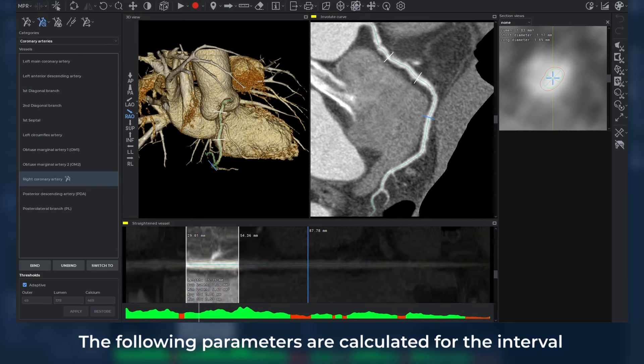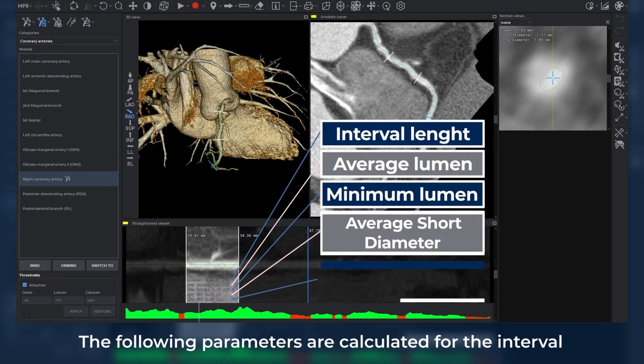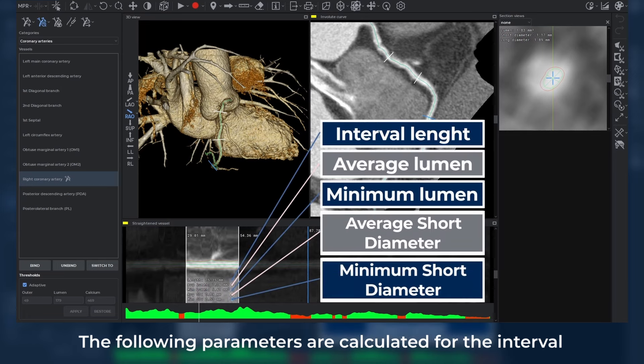The following parameters are calculated for the interval: length, average lumen, minimum lumen, average short diameter, and minimum short diameter.